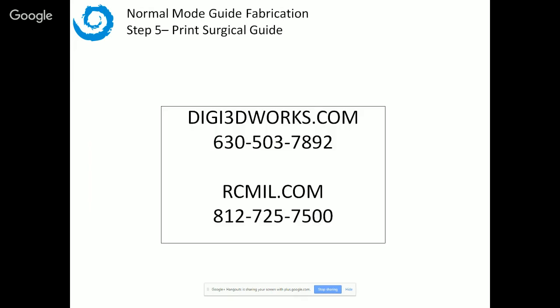Regarding printing of the surgical guides, if you have your own 3D printer, great. If you don't, there's 2 printing centers that will print the surgical guide for you. They both offer printing of the surgical guide for the ballpark of the $35 range. They also offer services of scanning the model as well, included in the price or for a couple of extra bucks. So here's contact information for printing centers that will print the surgical guide, and you could do the process yourself and have it printed elsewhere.